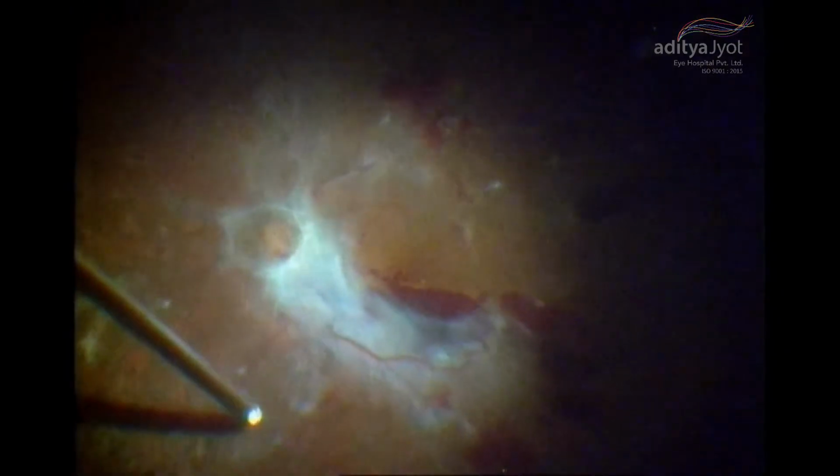So I am now inducing PVD, and you can see that I am using the cutter mode and suction mode, and then trying to induce the PVD, and you really have to use the 3D mode to enjoy the 3D of this particular part of the video.